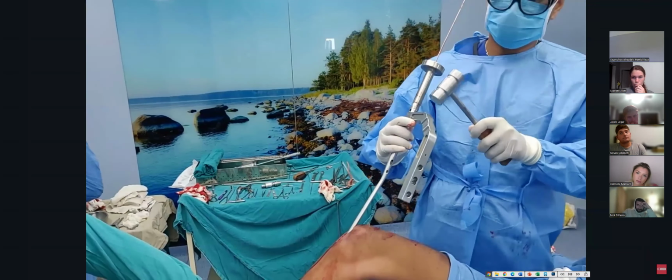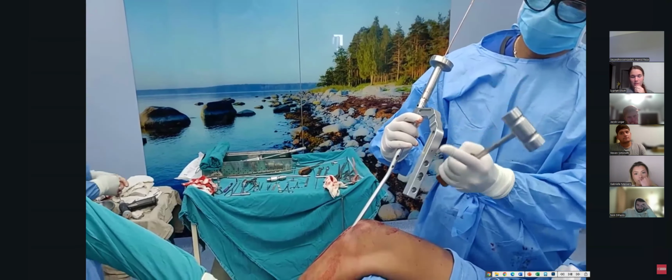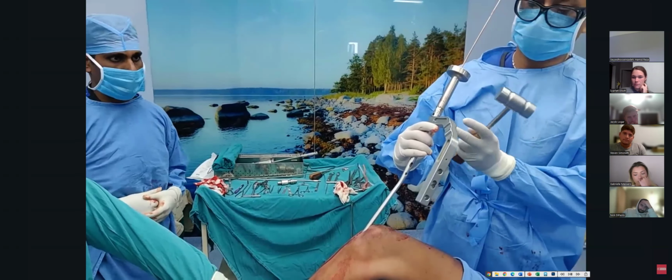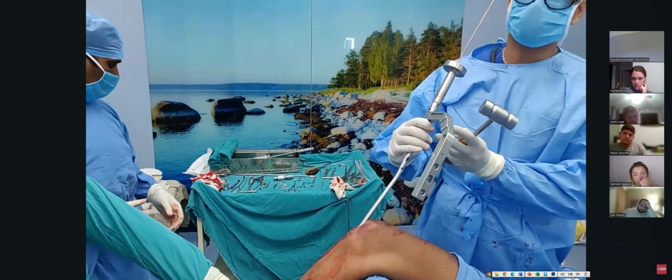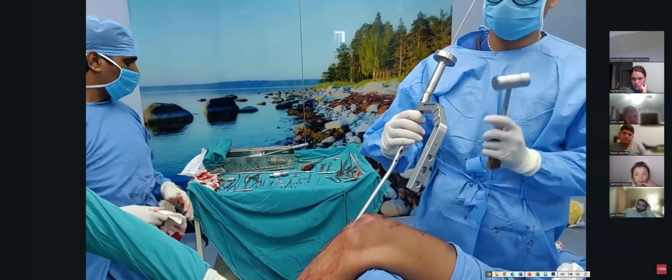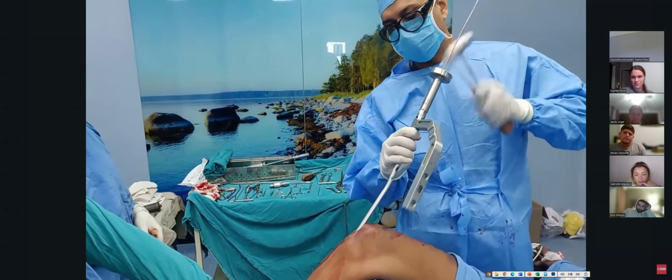So never mallet here. I've seen people malleting here. You can see, check that you will not see any mallet mark here, because if you mallet here, the alignment gets disturbed, and then there will be a mismatch between the holes of the nail. So mallet here. Just a gentle tap.